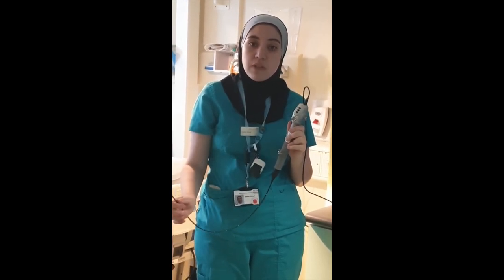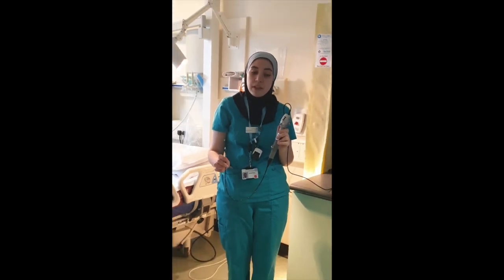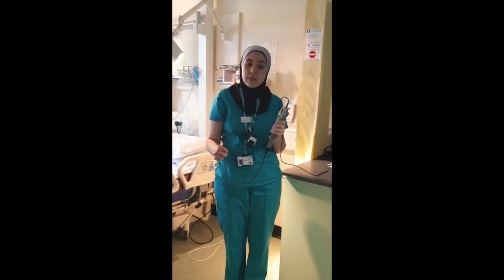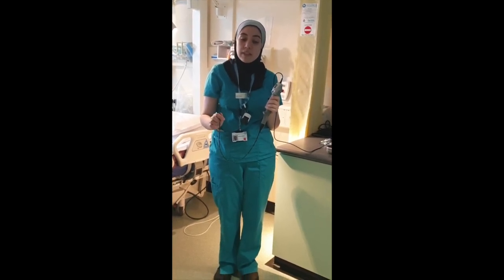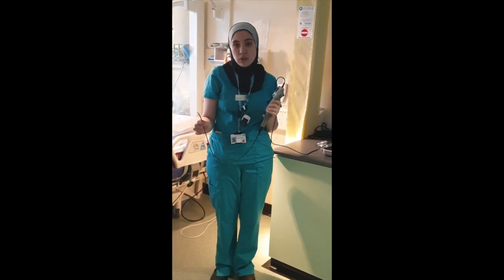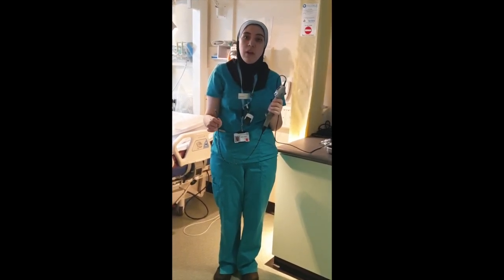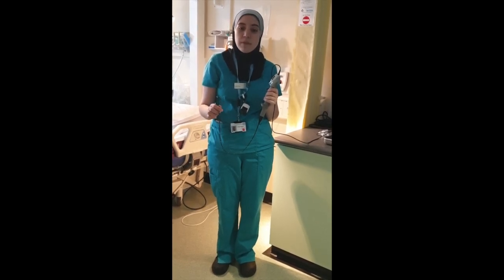Finally, once you finish using this bronchoscope, you must be very careful with it, because even though it's a very robust bronchoscope, it is fragile and one needs to take care when using it. Once you've finished using it, you cannot dispose of this as it's reusable, so you need to send it for cleaning and sterilisation, and that will depend on your trust.